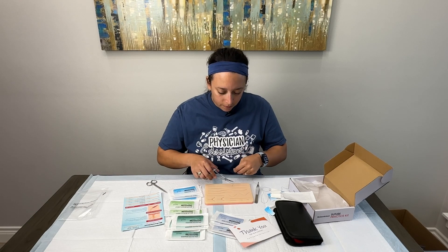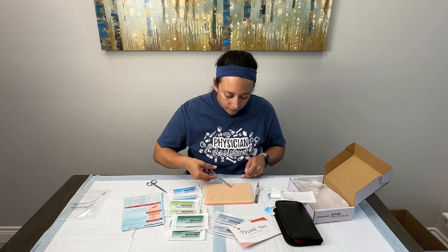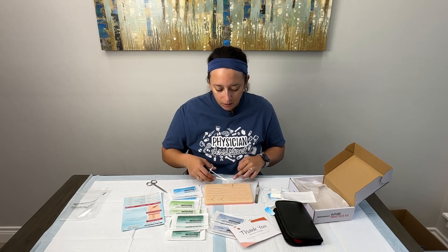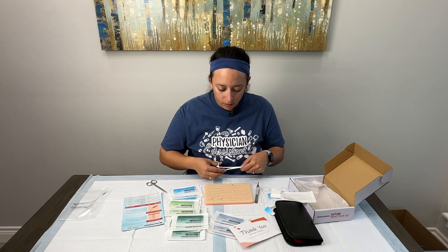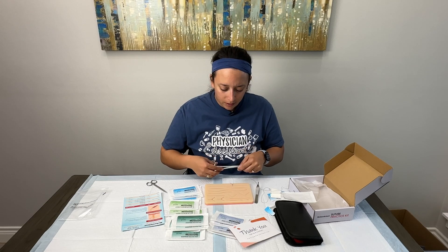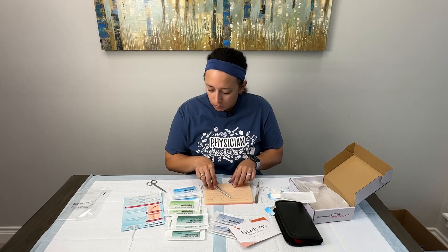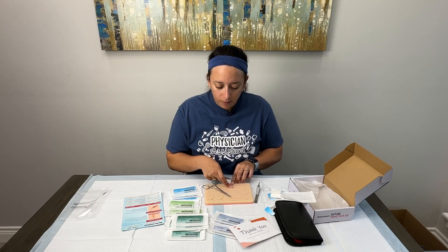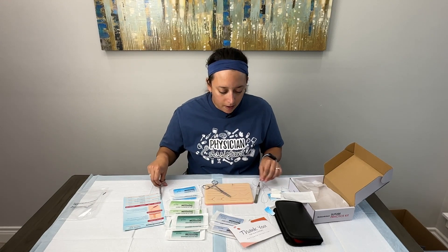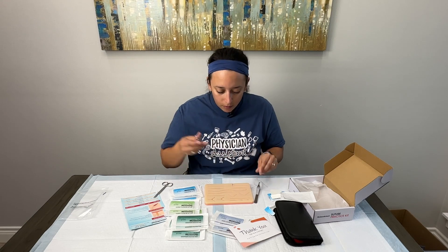I do like the silicone material — it doesn't look like it would easily rip through, which is nice. We're going to go ahead and tie this off. One thing I've noticed with silicone mats is that the surgeon's knot doesn't always hold tension on it, so it tends to come a little bit loose. But it's okay when you're practicing — it's not that big of a deal just to get the practice in. You can see there is a little bit of a gap, but that's typically how silicone mats tend to behave.